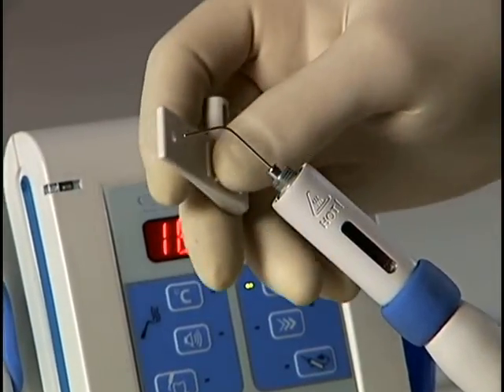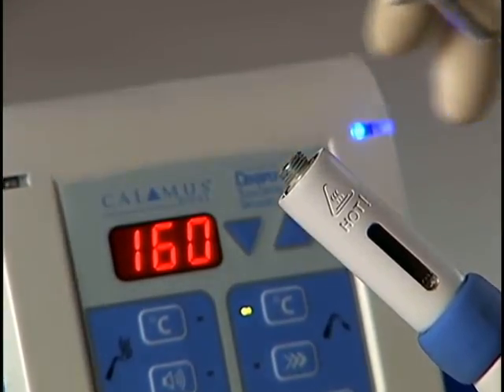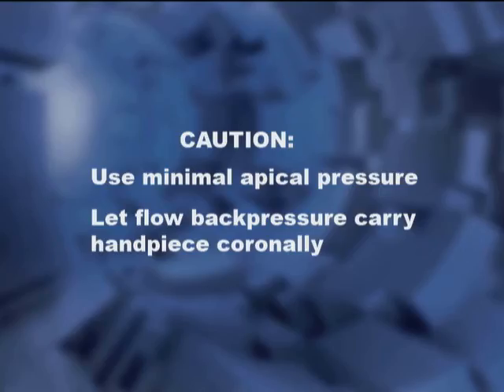We recommend using the ring in the bending tool to remove used cartridges. Caution must also be exercised when using the Calamus Flow device in the tooth. Too much apical pressure on the needle can lead to separation.